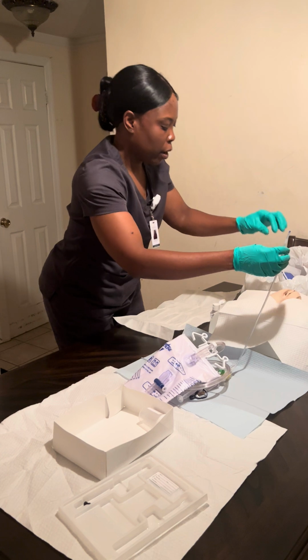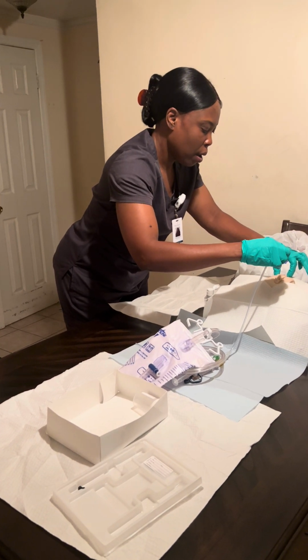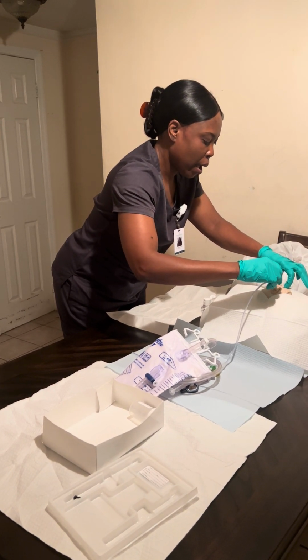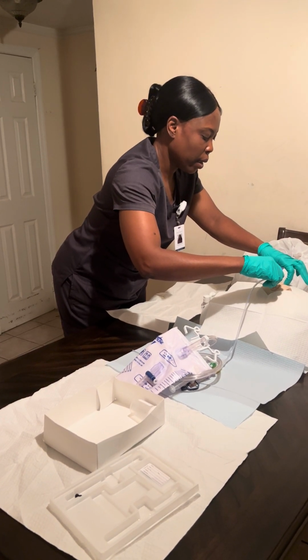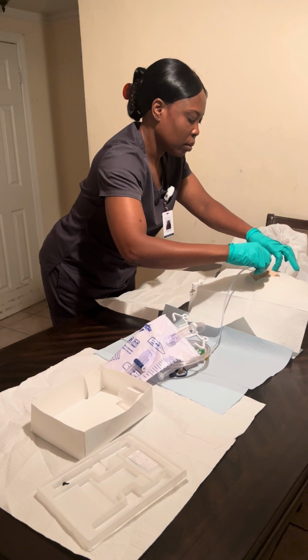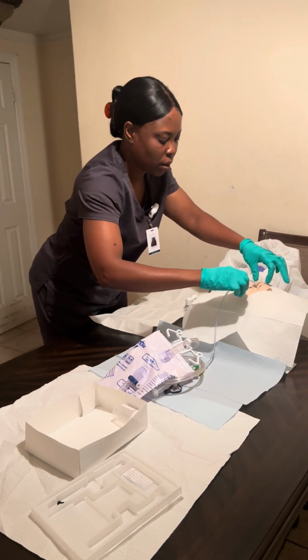Mrs. Smith, I'm gonna touch on you now. You're gonna feel my hand touching you. It's a little bit cold, okay? I'm gonna insert the catheter like 2 to 3 inches. I'm gonna advance. Can you take a deep breath for me, please? I'm gonna advance to 2 inches. Okay? Please let me know if you feel any discomfort, Mrs. Smith.